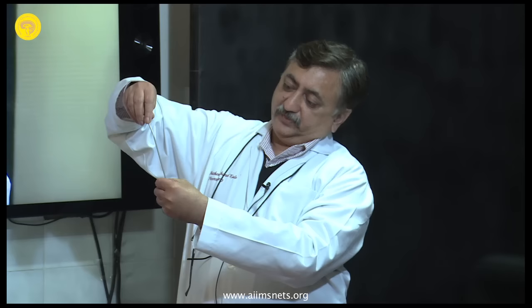See? As long as your angulation is correct, you'll go through this transverse process, you'll come out in the soft tissue, you'll keep going and you'll hit the body again over here, and you'll get inside the body. If you're medial, you'll go into the body. So you're in the bone, out of the bone, and again in the bone, but you're nowhere near the canal, so the neural structures are safe. Nothing is going to go wrong.